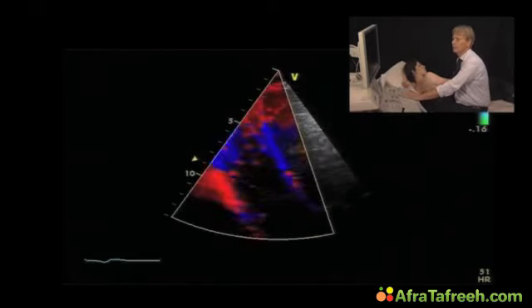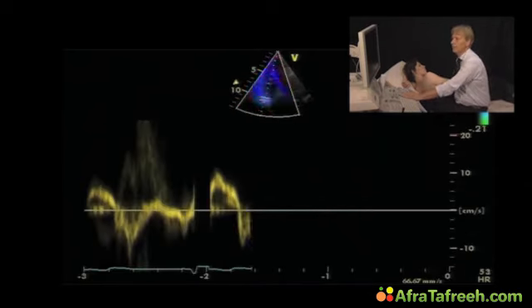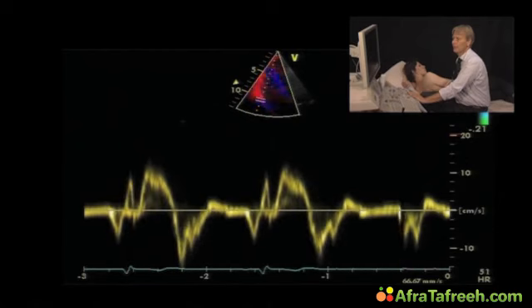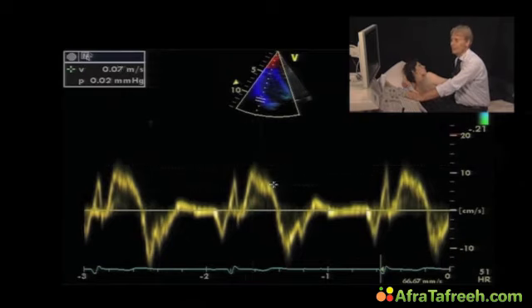Then we would put the color tissue Doppler display and the pulsed wave Doppler tissue display, freeze the image, and perform a calculation of the maximum velocity during systole, which is 0.12, in this case normal. This is systole, this is isovolemic contraction, and here this is obviously diastole.